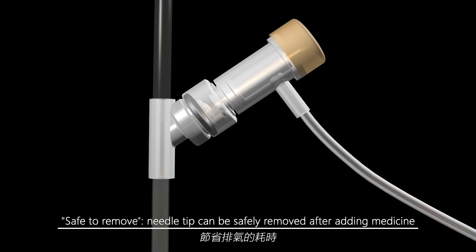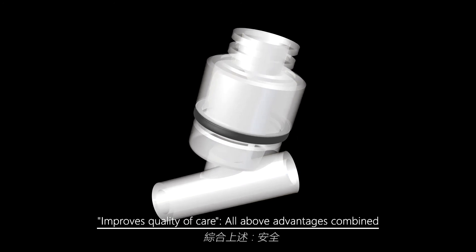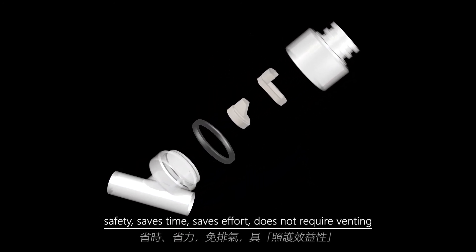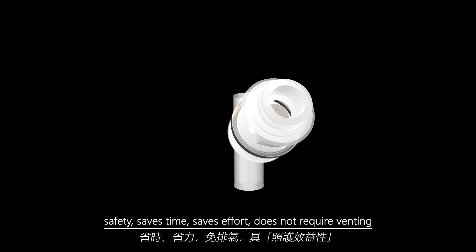Safe removal — the needle tip can be safely removed after adding medicine while avoiding risk of needle stick to patients or nurses, improving quality of care. All of the above advantages combined: safety, saves time, saves effort, and does not require venting.